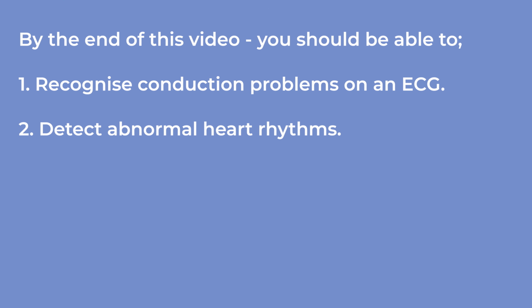But the difference between this video and the first video is that in the first video we looked at conduction cycles, we looked at normal sinus rhythm, and we looked at calculating rate and being able to have a 3D visualization of the heart. But in this video we're going to focus on abnormalities.